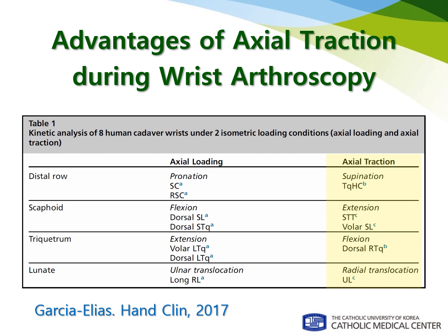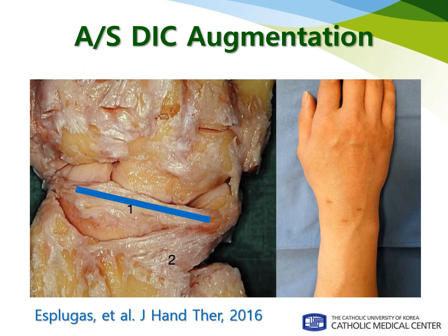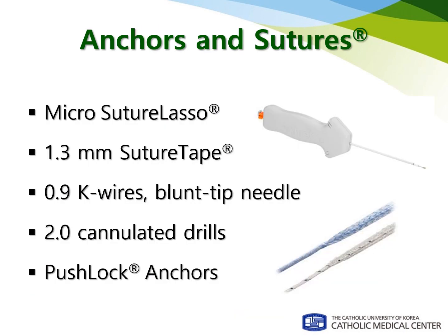According to Marc Garcia-Elias, when the scaphoid is extended and supinated, the lunate can be radially translocated by axial traction. Once the carpal bones are reduced with axial traction, I decided to place a non-absorbable suture alongside the dorsal intercarpal ligament via the STT and MCU portal and fix the suture to the scaphoid and triquetrum with two anchors. For this procedure, I chose 1.3 mm suture tape, passed with a microsuture lasso from Arthrex. To make a drill hole, I used a blunt-tip needle as a guide and 2.0 mm cannulated drills. For suture fixation, I used two push-lock anchors, 2.5 mm in size.